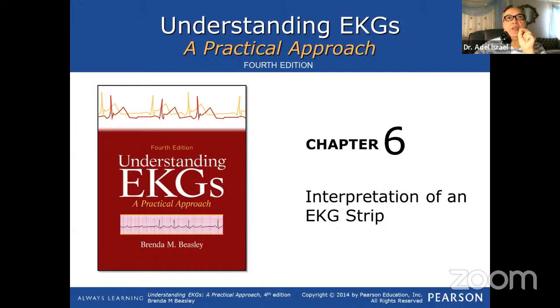If we take this 0.12 second, or the PR interval range, which is between 0.12 to 0.20 seconds, we can express it in small boxes. The PR interval ranges between 3 to 5 small boxes. The normal QRS should be less than 3 boxes. Clear? This is the most important topic.